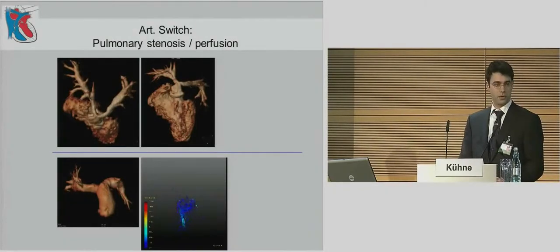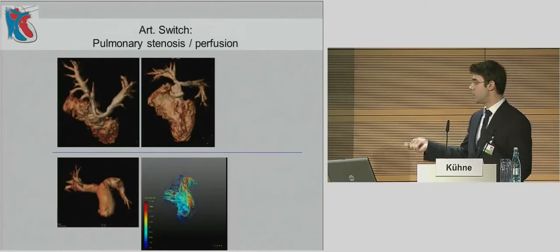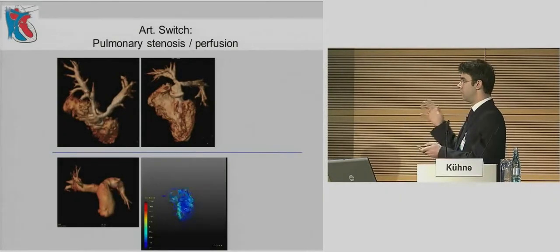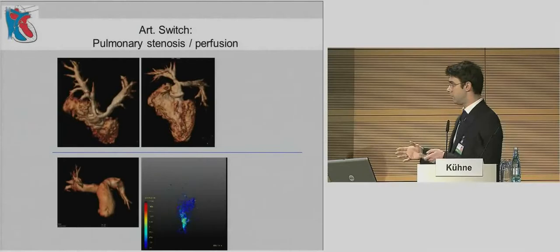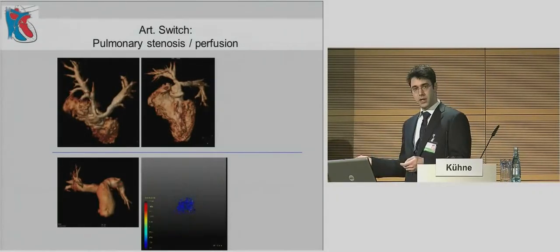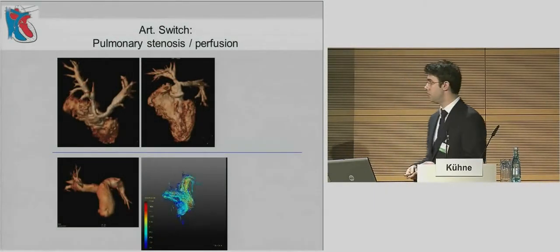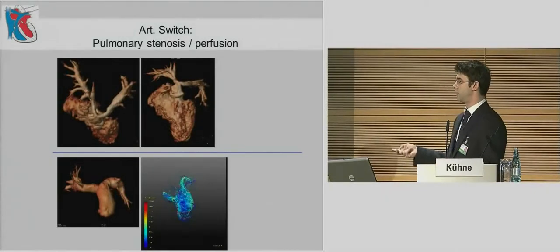Let's say we have 40%. What can we do with this patient? Probably there are not too many things we can offer this patient in terms of treatment, how to improve the situation. And the goal should be not only to think about whether we could maybe improve with a stent or not. Basically, with our methods available here and applying some computational fluid dynamics, we can probably calculate in the near future what the outcome will be if we place a stent in such a patient.